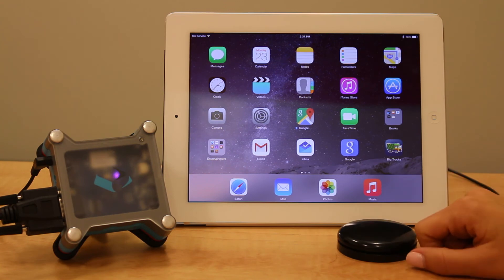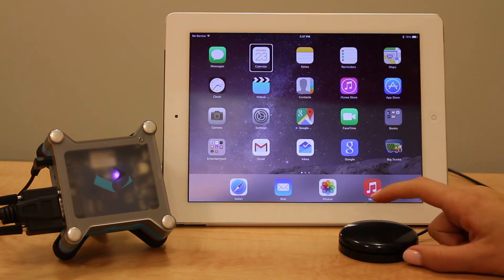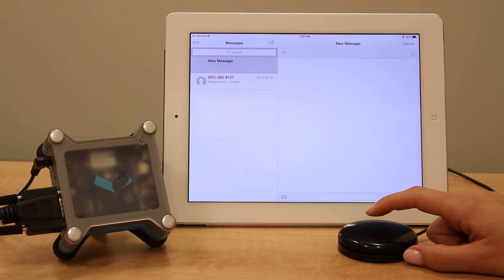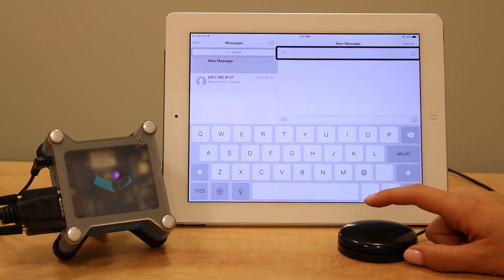A one switch press starts the scanning. If you press again, you can change the direction of the scanning. If you press and hold, you select the item that's currently highlighted. If you continue pressing, it will show or hide the keyboard, cancel, go home, or activate Siri — in that order — when using a single switch.